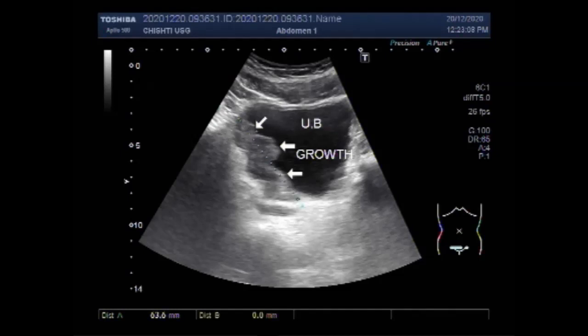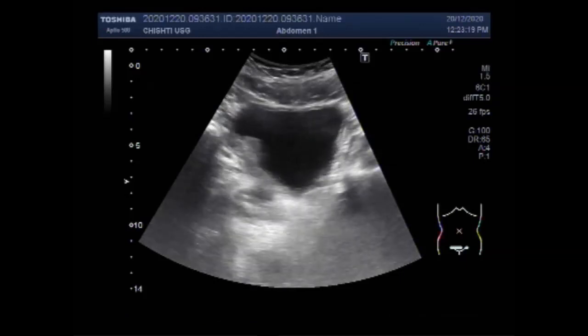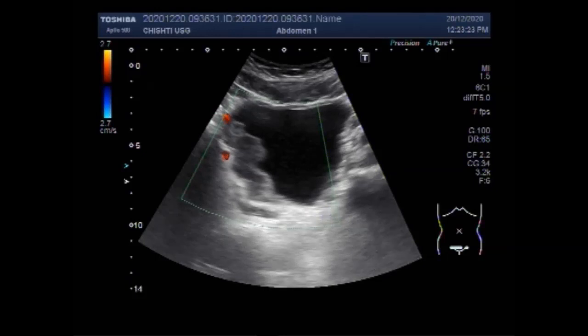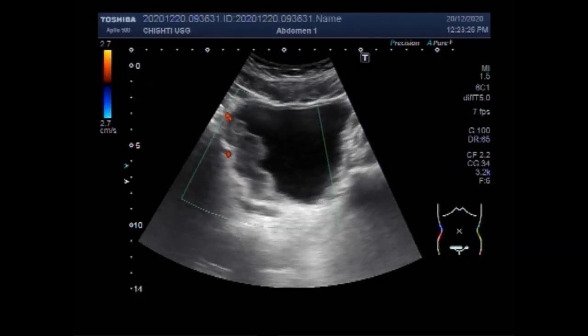An ultrasound scan is used to show if cancer is present, if the mass is present, and how large it is. Ultrasound cannot always find small tumors, so additional tests may be required. Ultrasound scan with the full bladder is mandatory to see all the findings.